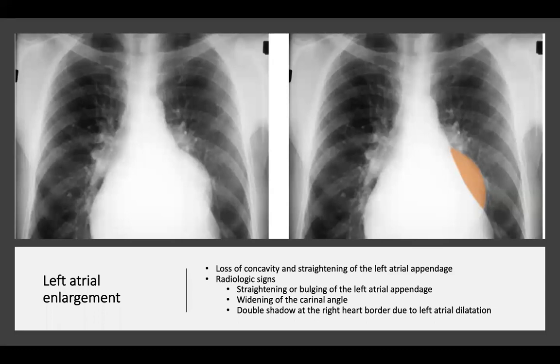That was an example of left atrial enlargement. The left atrium may be seen on a PA chest x-ray as the left atrial appendage, which is normally concave in shape. If the left atrium is enlarged, there is loss of concavity and straightening of the left atrial appendage, and sometimes it bulges outwards. Radiological signs include straightening or bulging of the left atrial appendage, widening of the carinal angle, and a double shadow at the right heart border. The images show the left atrial appendage bulging out with the right heart border appearing further to the right than usual, with the left atrial appendage marked in orange.